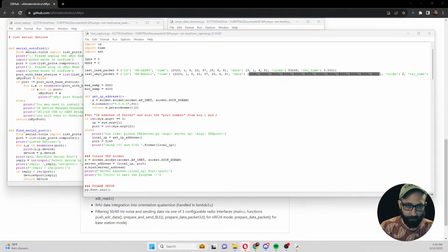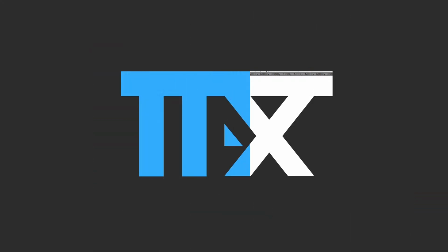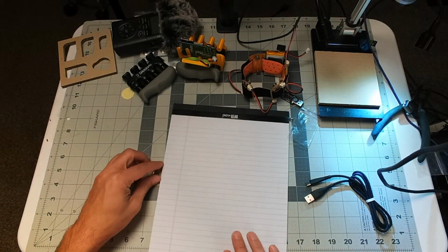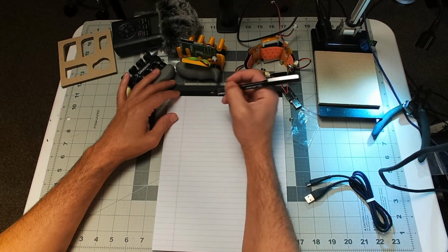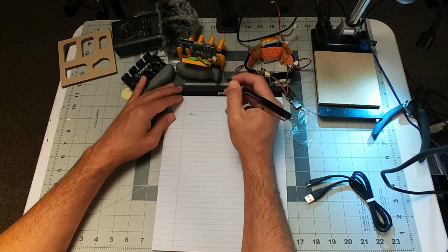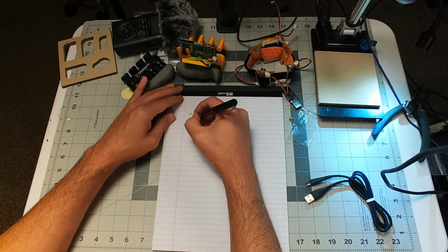So we first have to get a structure. So I'm going to design this in Illustrator. I do most of my design work in Illustrator. But let's see. I do have a pen and paper too. So, okay. So what we have is how many samples per second? So we have uMyo times 4. And each of those 4 gives us 8 data points.